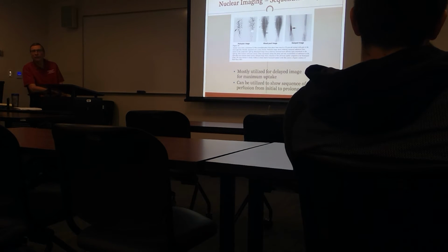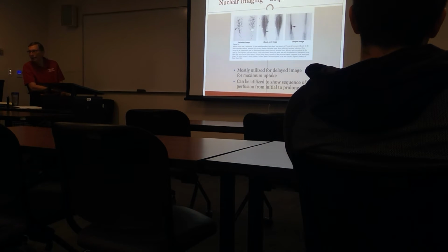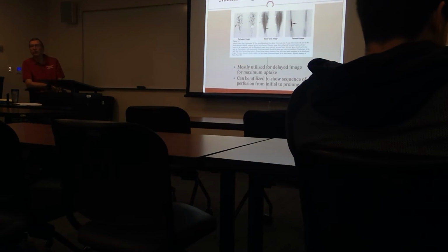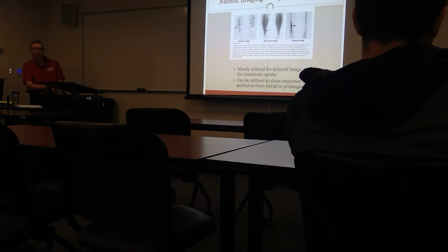Mid to lower shaft of the tibia. Stress reaction, stress fracture. Yeah, this is one of the ways they used to be able to diagnose it, but it's a killer because you're absorbing radiation. So it's an expensive way to do it, but if you can't find one, these will always pick them up. So they will still use these, but not necessarily first run.